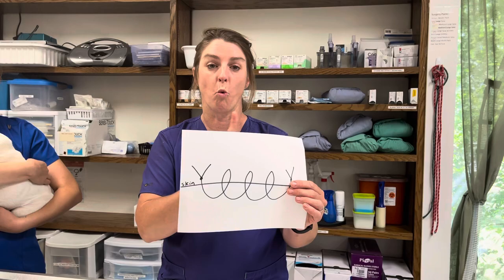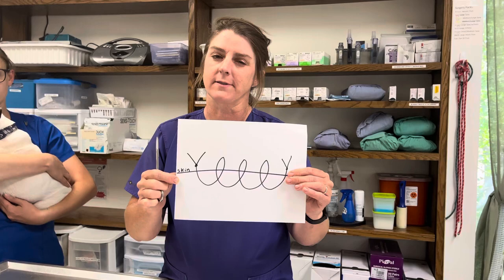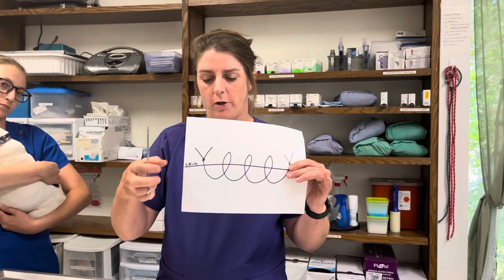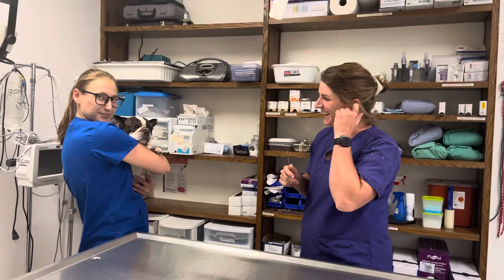The last type, which is the hardest one to take out, is a simple continuous — that's one line of suture with a knot on each end. You have to be very careful: if you were to cut this in two spots you could leave a little suture under the skin. We don't do this one very often, but every once in a while there is one. You can only cut it in one spot right near the knot and then pull it all the way through, which sometimes feels kind of creepy.